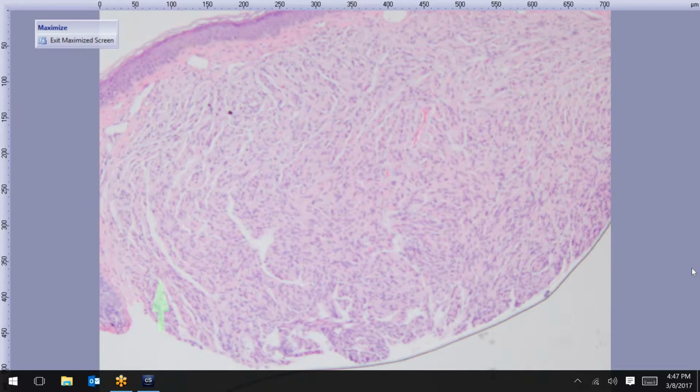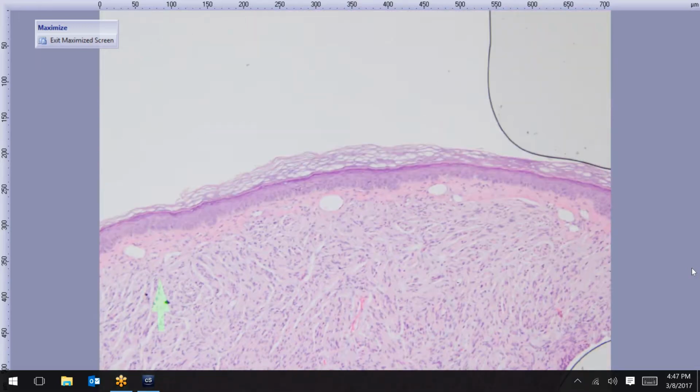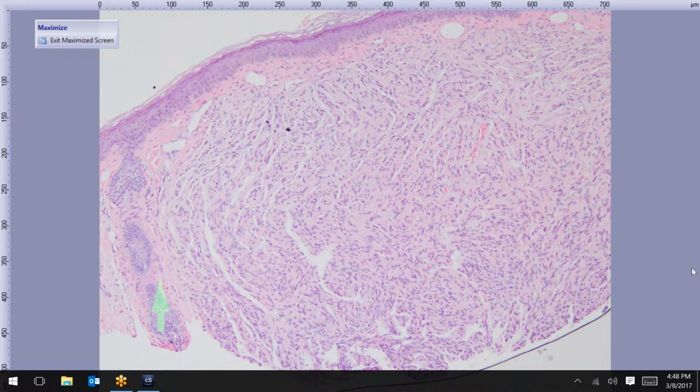All right, anyone? Any thoughts on this one? Is that more representative of what they're seeing on that TV screen or on the laptop? The laptop would be the, depends on the screen. Yep. Okay. So I guess they have a screen.